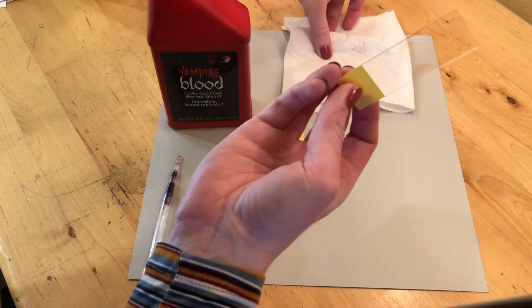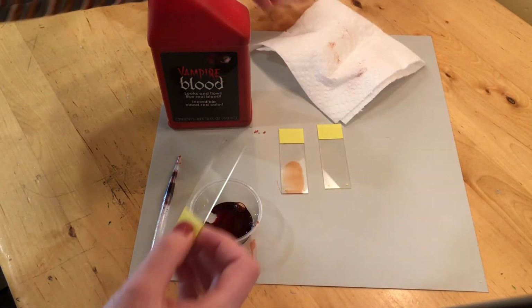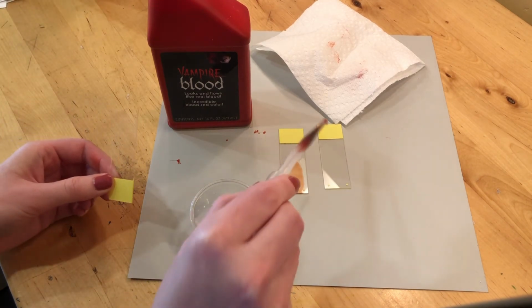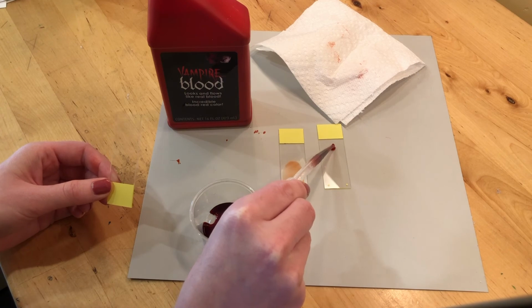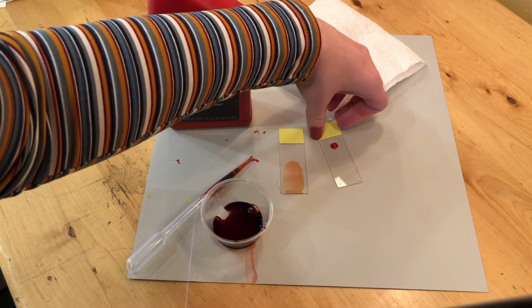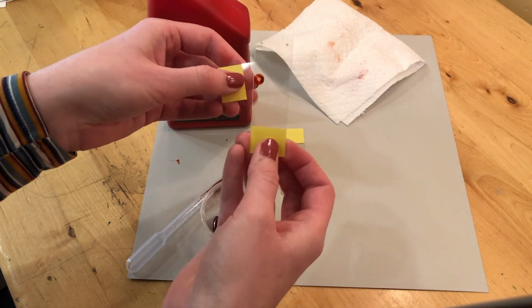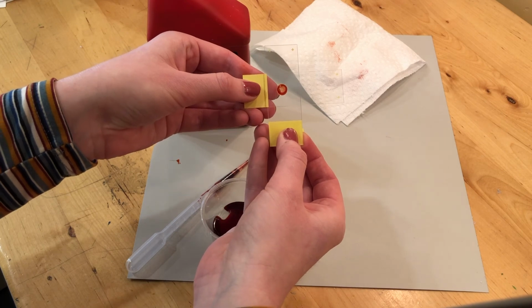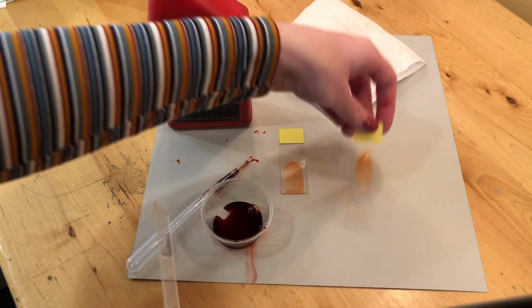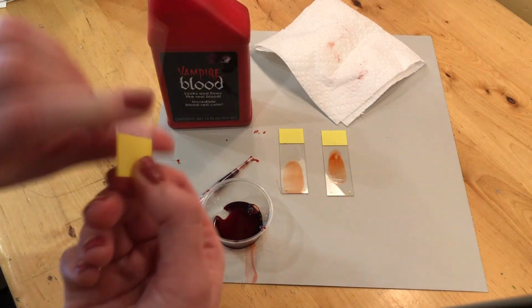So we can do that again and we can actually reuse this slide. So I'm going to wipe that off and we will do it one more time. This one I'm going to put a little higher up just to get a longer smear. And again, putting both rough sides together, or the front sides of both. Press down, light pressure, even. Drag it across. And there we go. We have 2 great looking smears.